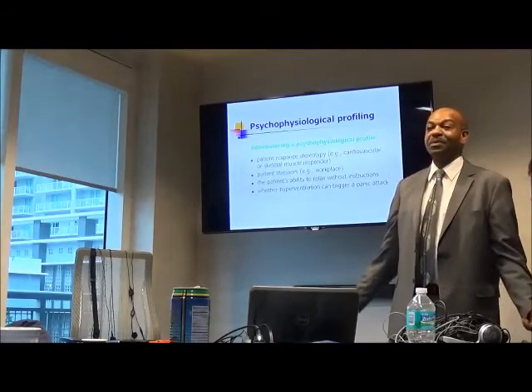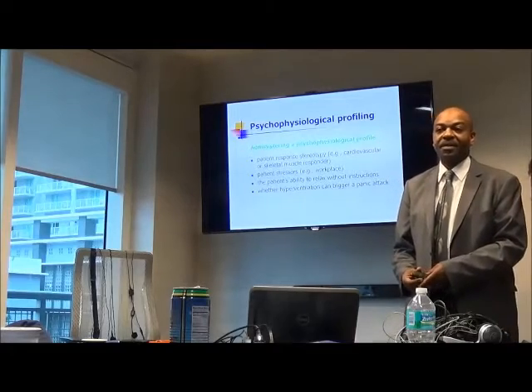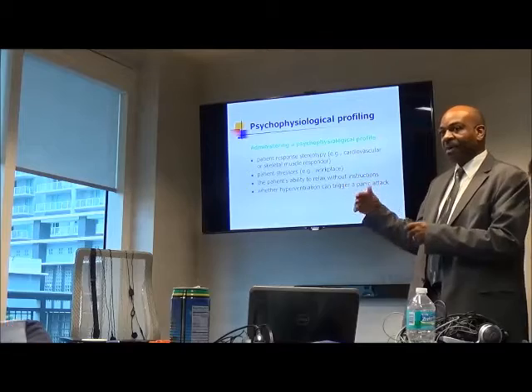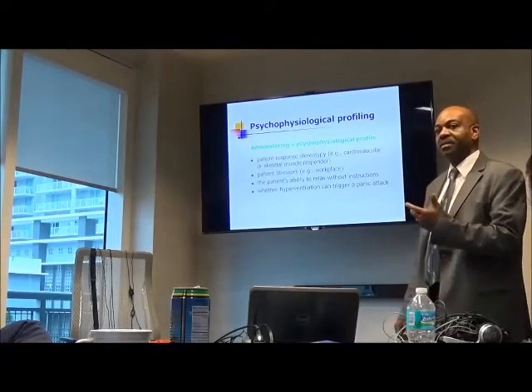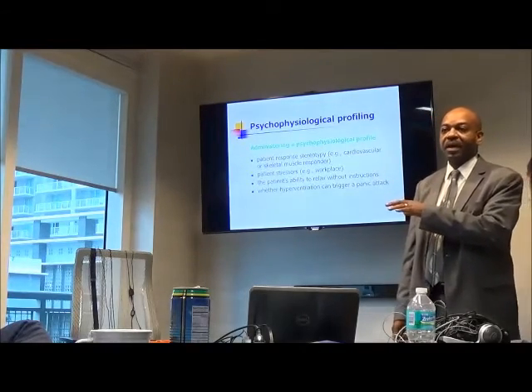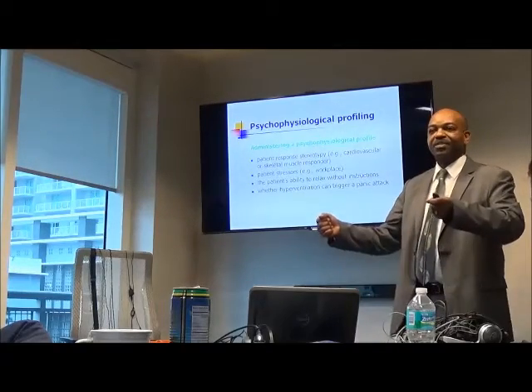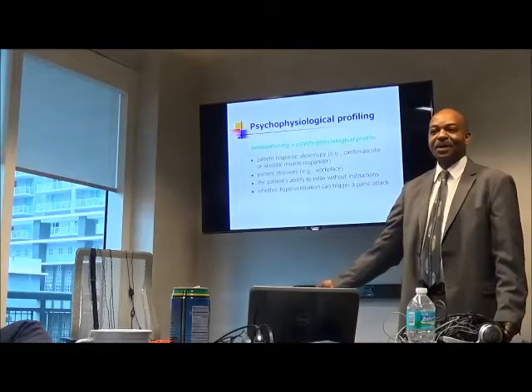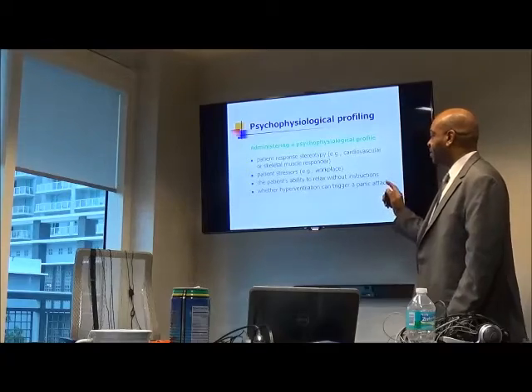So it's not that they don't know how to relax, but when they're doing certain tasks, they don't know how to relax. So you may see that they can relax during this, but you see the reaction under stress, and you need to get them to be able to relax to an extent even during a task. You're not going to expect that as a person is lifting something, their muscles are going to be as relaxed as if they're just sitting on the couch. Of course. So you do want to see whether they're able to relax without instructions.